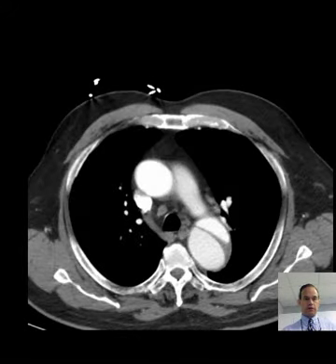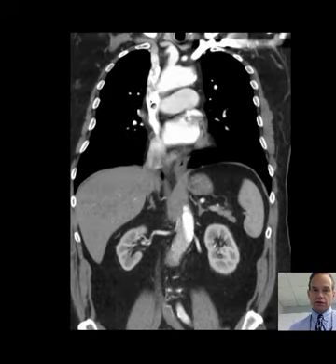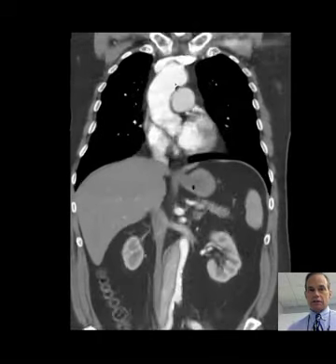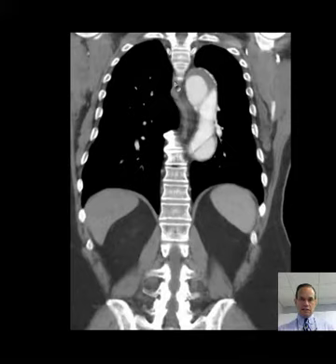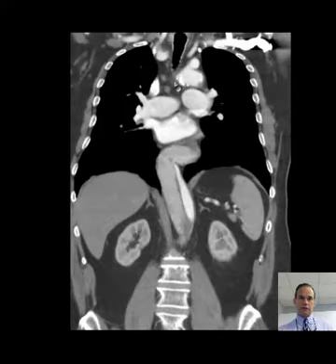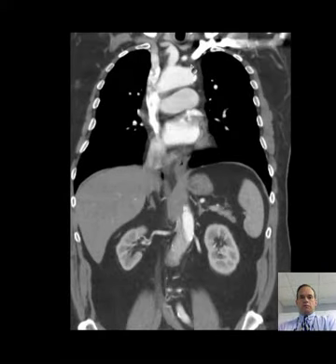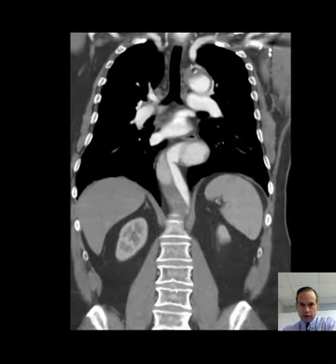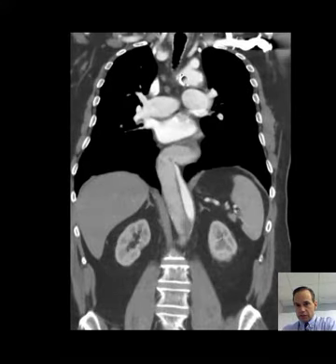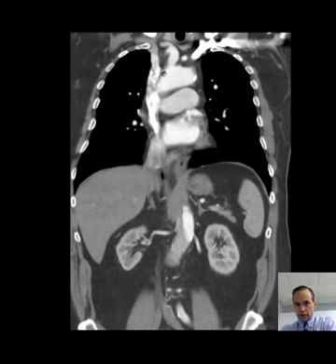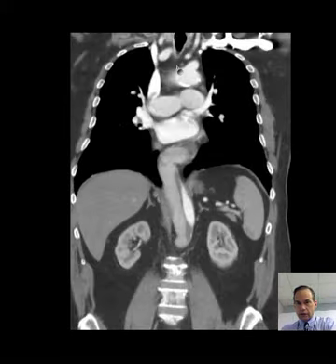I think you'd probably be able to see that even better on the coronal images. Here we have the aortic arch, and here is this dissection beginning just distal to the left subclavian artery. You can see that there is dense contrast opacification in the ascending aorta and in the aortic arch, and just beyond the origin of the left subclavian artery — that's the brachiocephalic artery, then the left common carotid artery, then the left subclavian artery.